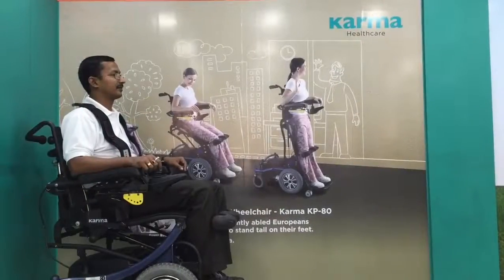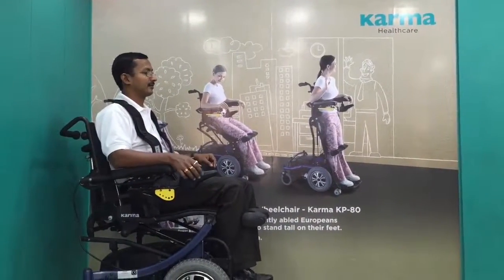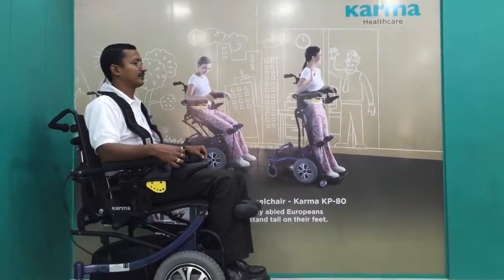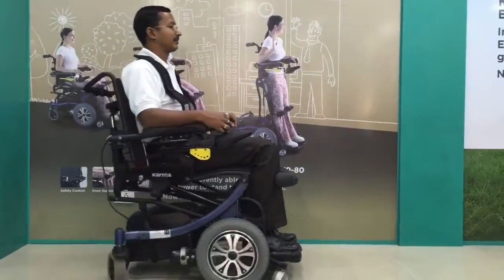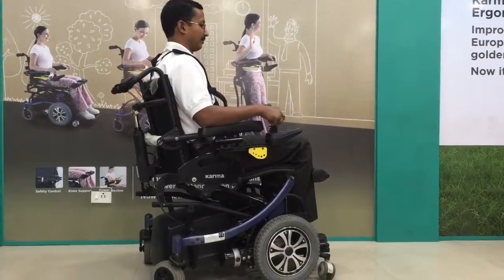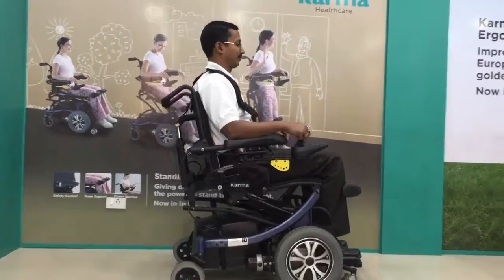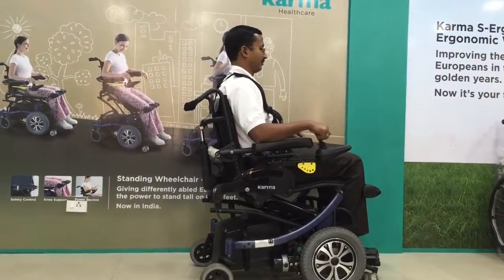Now we show how the KP80 works. You need to turn on the joystick and then you can move forward using the joystick knob. The wheelchair is moving forward, and the same way you can move backward by moving the joystick knob to the back position.